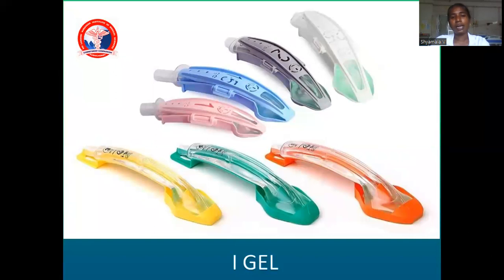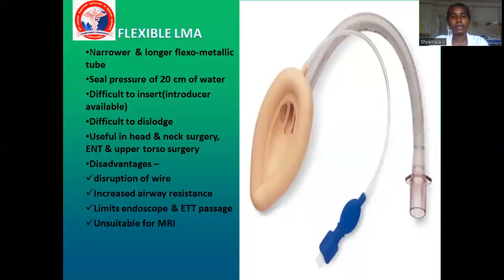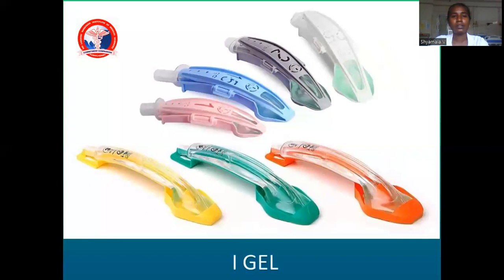This is the flexible LMA, and this is the cuffless pre-shaped one, the I-Gel.